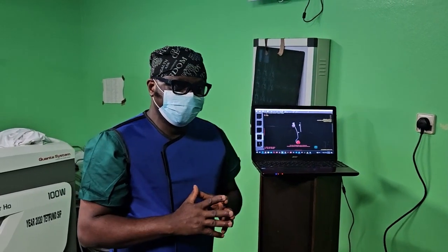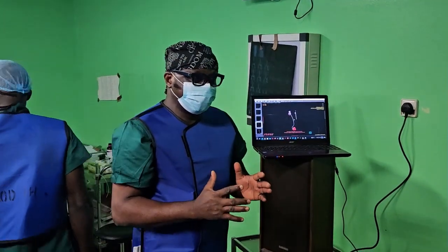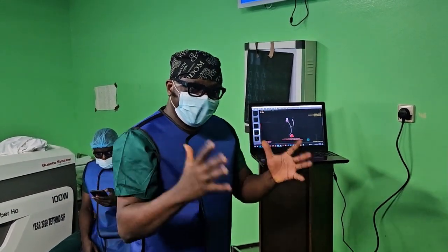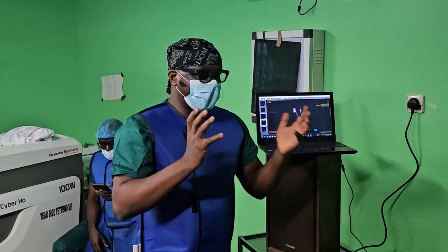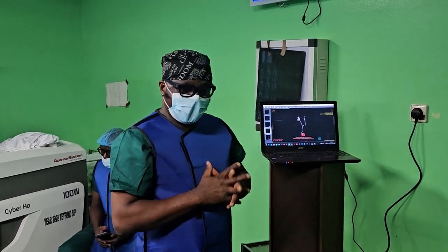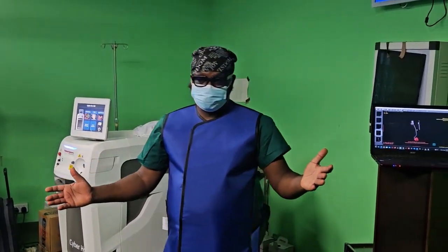So you can see, doing a safe PCNL starts from reviewing the image. You must have a DICOM viewer on your laptop that affords you the opportunity to see the image in coronal view, axial view, sagittal view, and to give you a digital subtraction image that you can rotate back and forth to have a fair idea of the pelvicalyceal tree. So that is the starting point. Having reviewed the image, then we come to the setup of the theater space.